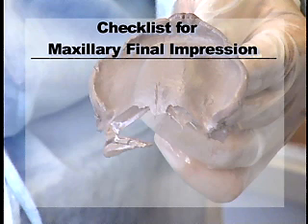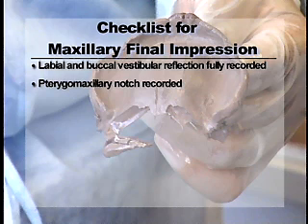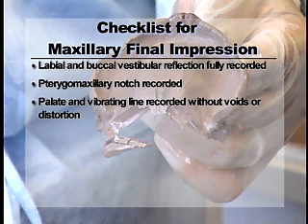Checklist for maxillary final impression. Labial and buccal vestibular reflections are fully recorded. Pterygomaxillary notch is recorded. Palate and vibrating line recorded without void.